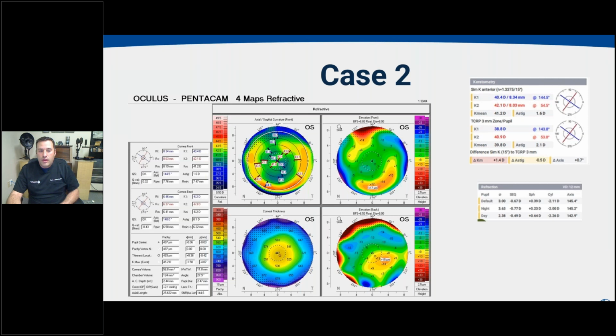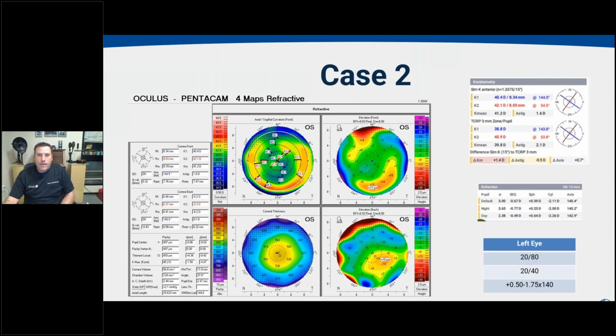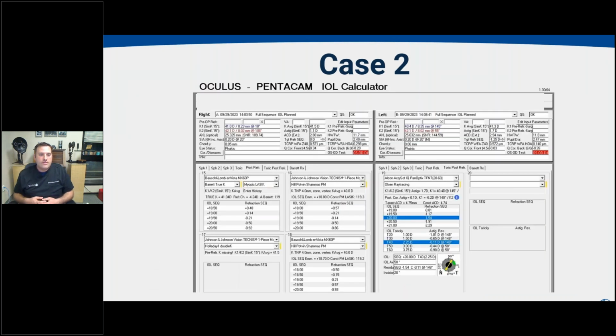And then you can pull up their auto refraction data, which, again, I like to see. Refractions don't matter very much in terms of your cataract surgery, but I do like to see that the refractive axis still lines up with our corneal axis. It's even more reassuring that the cylinder correction we're getting does appear to be in line. And then even our manifest refraction lines up as well. So with all of the data that you're generating with the AXL Wave, we can now strongly consider placing a low power toric lens for this patient.